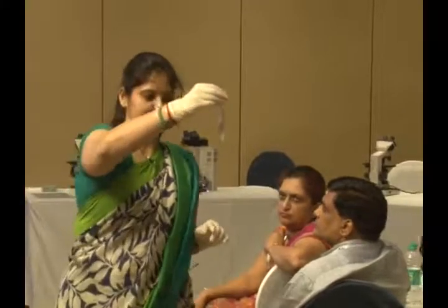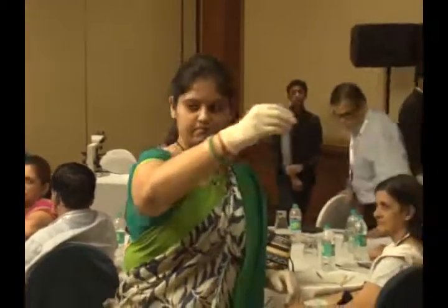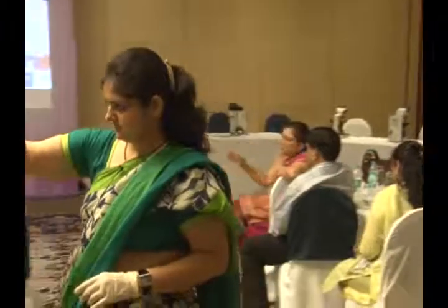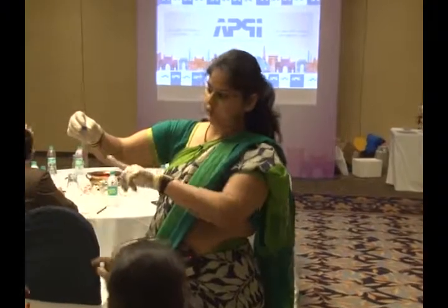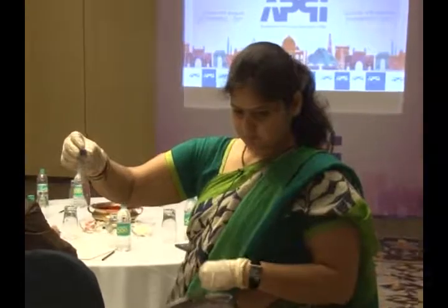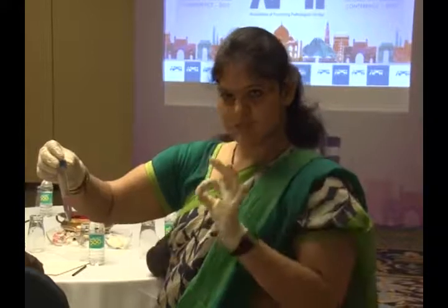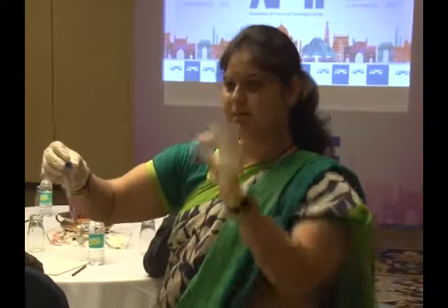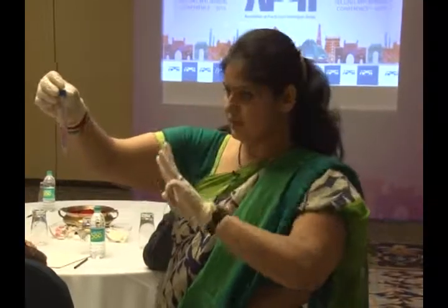So this is semen, this is lower, this is higher, and it will get separated at the interface. See, first you take lower density, go underneath, release the higher density, and the semen sample goes at the top. There have to be 3 clear layers.